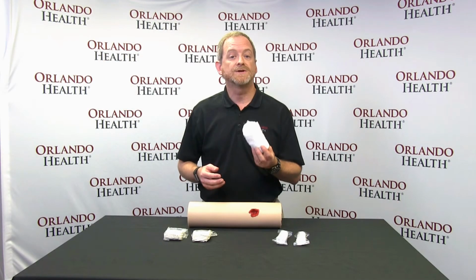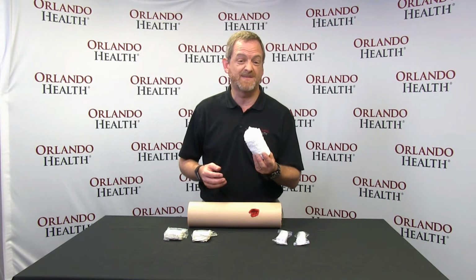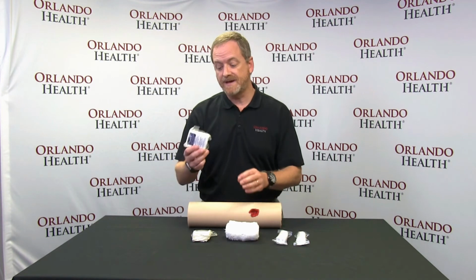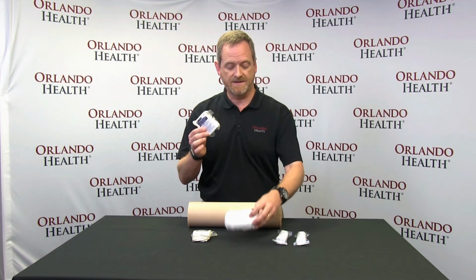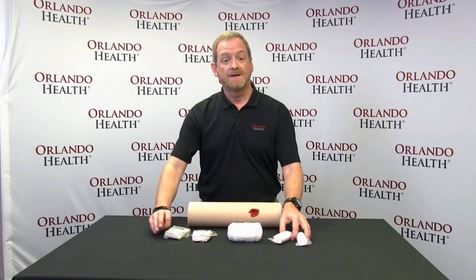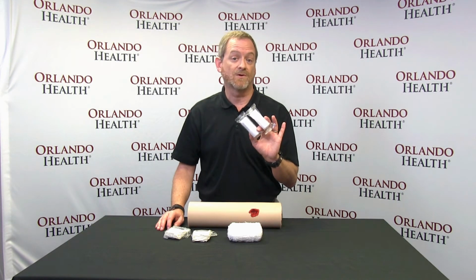Regular gauze will work just fine for the majority of wounds that you might encounter, and it's much less expensive than the hemostatic products. If you're concerned about space, you can buy these compressed gauze rolls, which are the same size as this, online for a few dollars each. If you're really concerned about cost, I found these at the local dollar store for, you guessed it, $1. At that price, you could pack several of these into your Stop the Bleed kit.